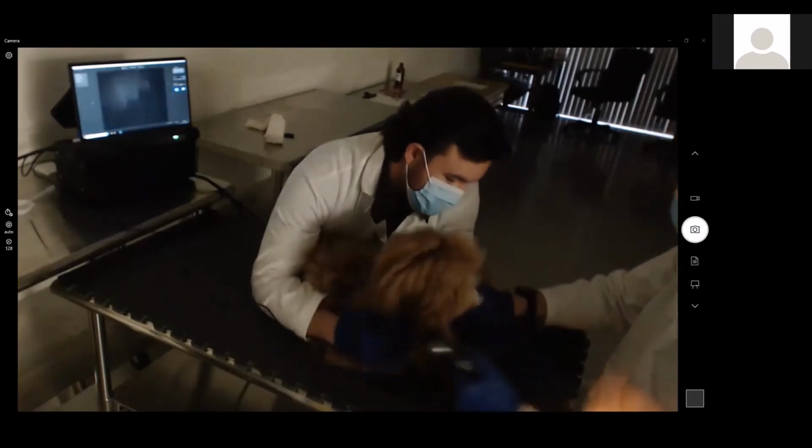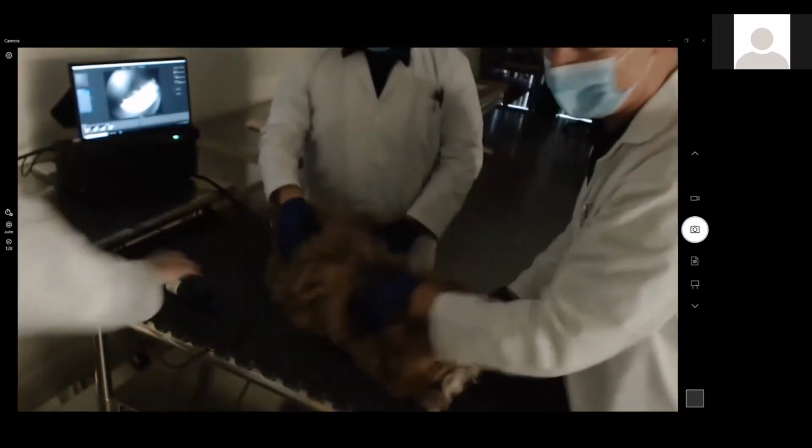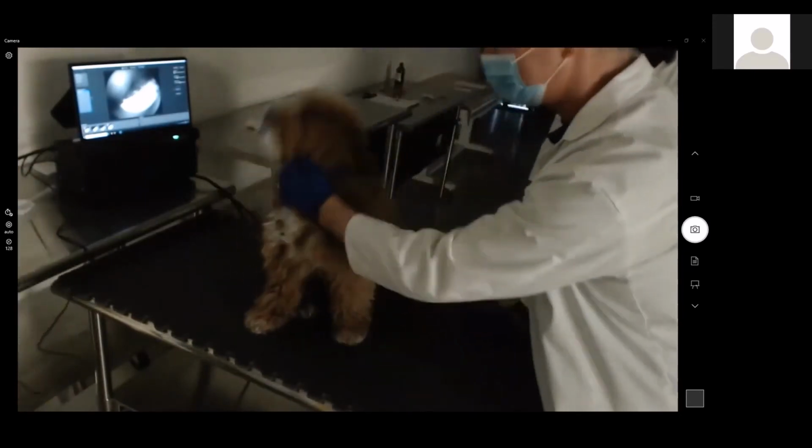Okay, I think that's going to be the end of our exam. I think my dog has had the limitations. He's like a child, got to pay attention for about 5 minutes, and that's it.